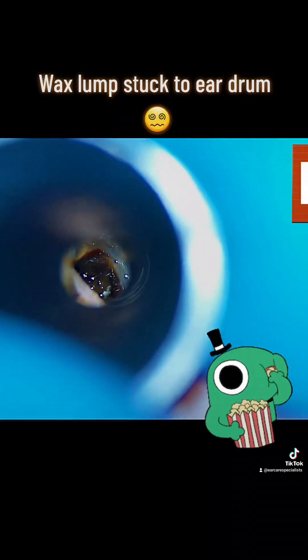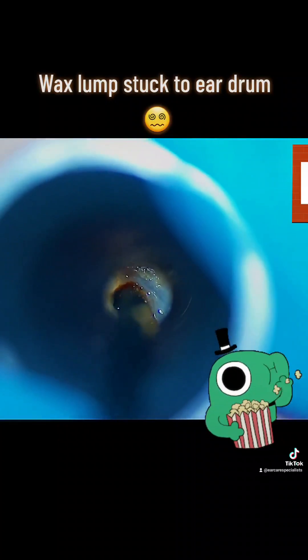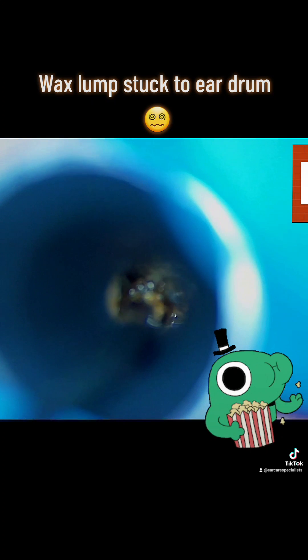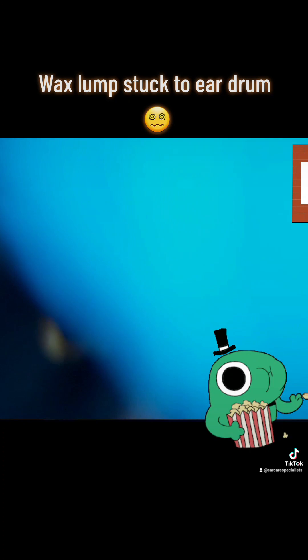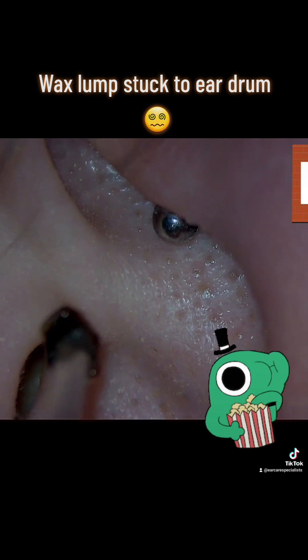We just increase our magnification level to 12.5 and this gives me a really good view of the eardrum, so I can very carefully go in and just grab the wax with the suction there and out it comes. The patient didn't feel any discomfort with that and their hearing was improved afterwards.